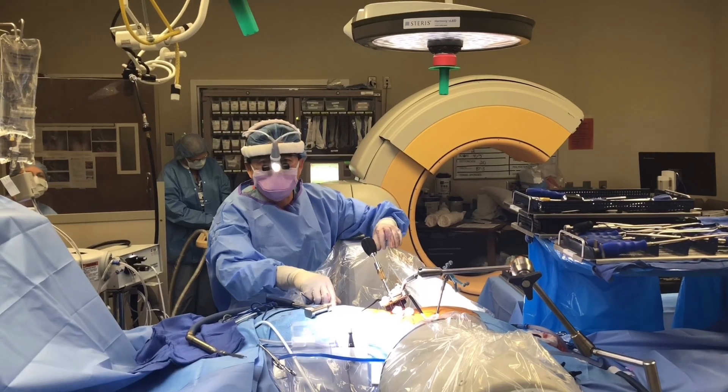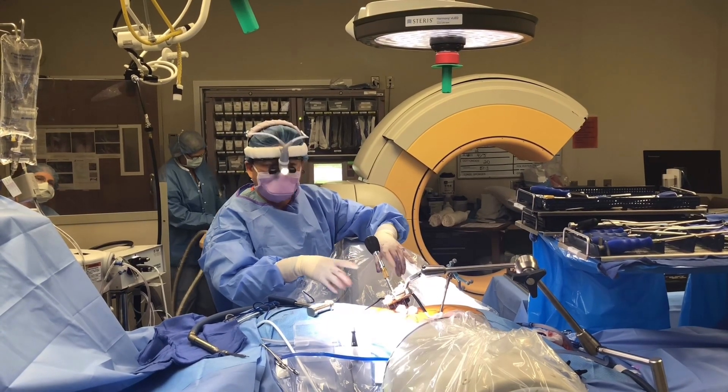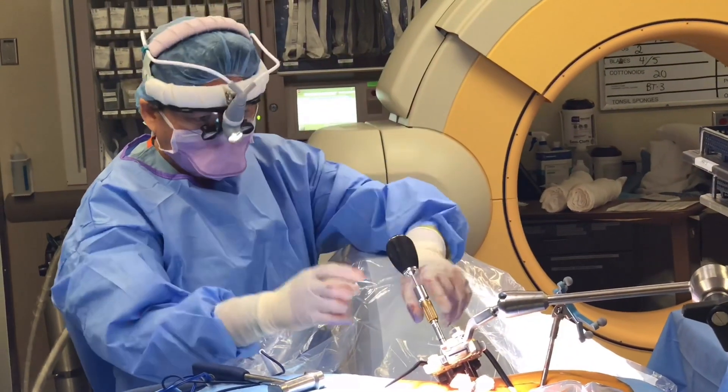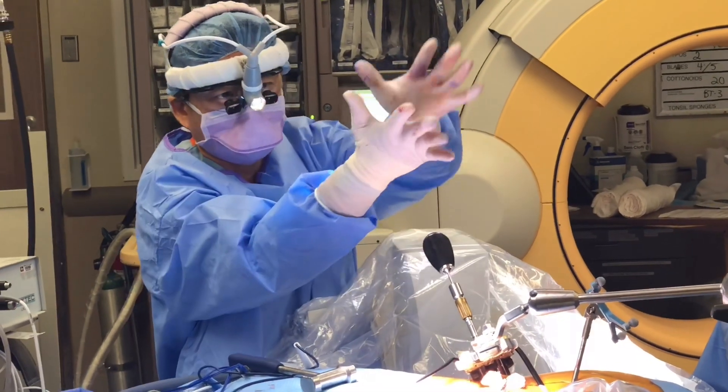We're in the second half of the surgery now. I have the expandable cage from the back put in — the first of two. I'm going to turn this driver to expand the cage up. It'll jack up like a car jack. That way it goes in small and gets bigger and bigger and bigger.